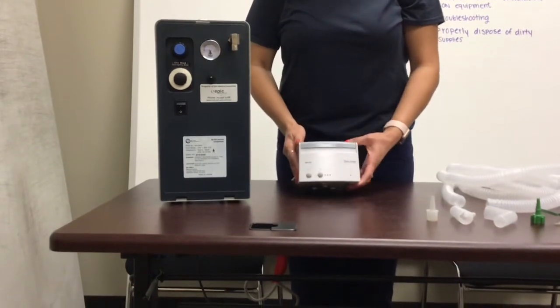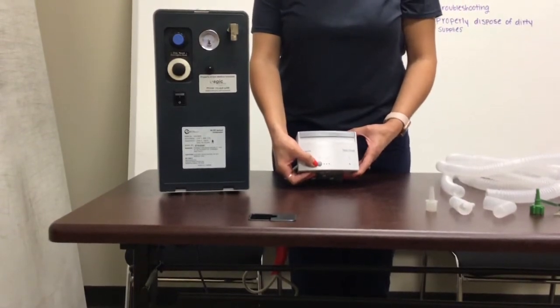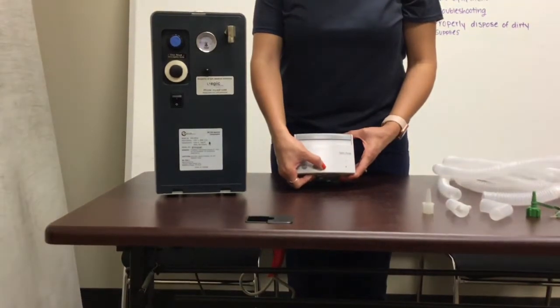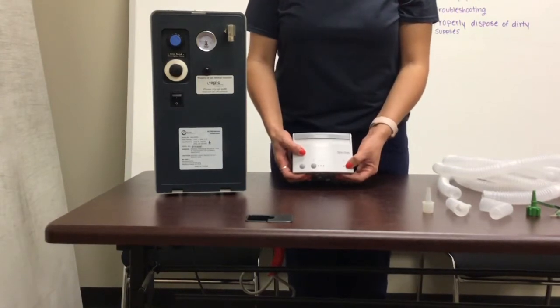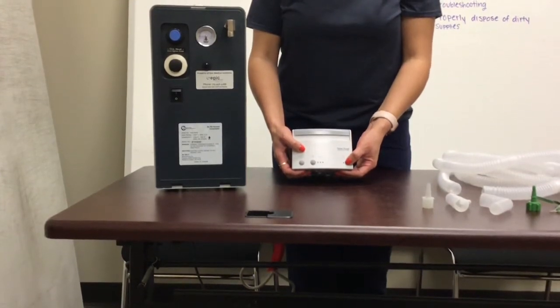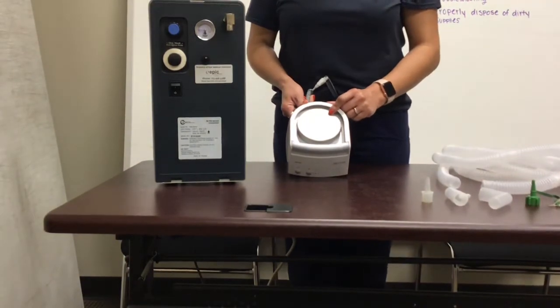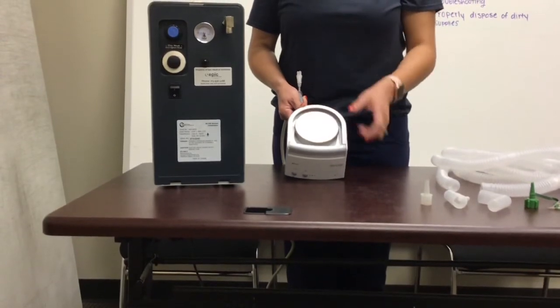On your heater, you will have your on and off button. Next to your on and off button will be the button to select the setting for the amount of humidification that is needed for your patient. The first being the least amount of humidification and the third being the most. There are 3 different settings. On this side of your heater will be a light that will light up if you have any malfunctions with your heater. You would then call somebody here at Aviana to have your heater exchanged. On the top of your heater will be a plate which will be heating up the water to provide for your trach collar. Please be careful not to touch this plate because it will be very hot.